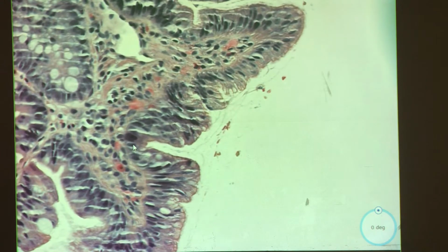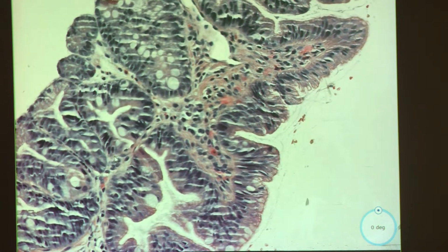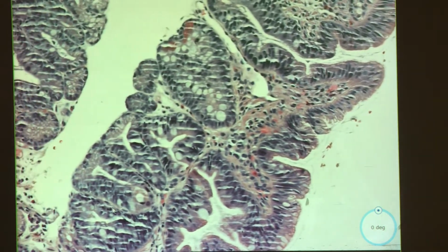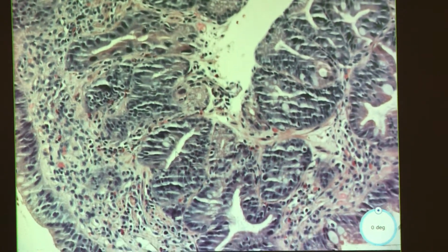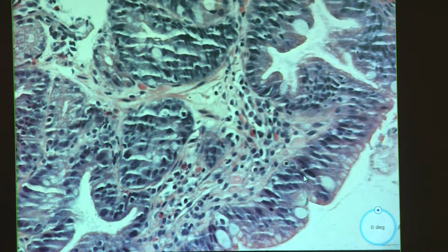Okay, and what do you mean by dysplasia? Like, probably just atypical nuclei, loss of polarity. It's hard to tell because some of these cells look bigger, like higher NC ratio, a little darker, but I'm not sure if that's from processing or just it's not projecting well. That's fair. Just based on this, I'd kind of say there is some dysplasia, even though it seems like they're still preserving their orientation, but some of these nuclei just look kind of off. Okay, what else is in the stroma?